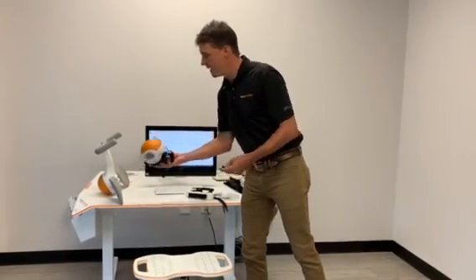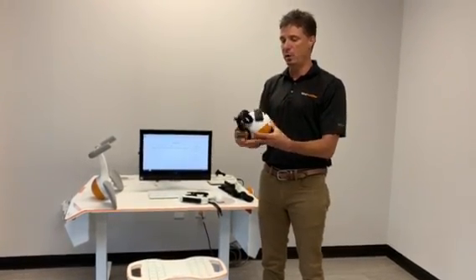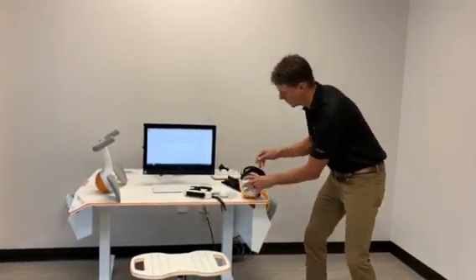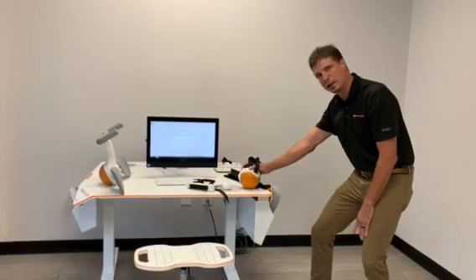One of the other accessories is called a multi ball. You can take one of the sensors, place it inside the multi ball, place the patient's hand in the ball, and then the patient's hand can go on the table. They can then do motions like wrist extension, internal and external rotation.